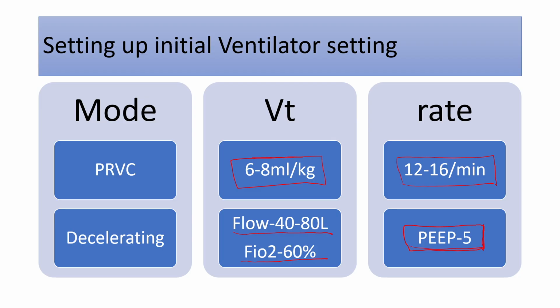In the advanced next session of this lecture we will see how to set up the PEEP. But remember that positive end expiratory pressure has some hemodynamic consequences as well, and there is a heart-lung interaction during mechanical ventilation which we are going to study. So the setting of PEEP is as per the saturation and the tolerance of the patient, to get the optimum PEEP where you get good saturation without hemodynamic compromise. This we will study in the second session of the mechanical ventilation lecture.